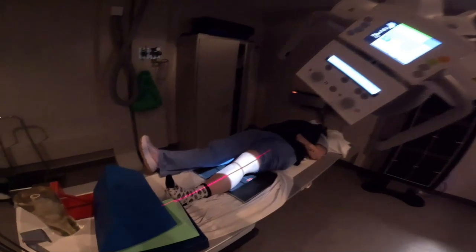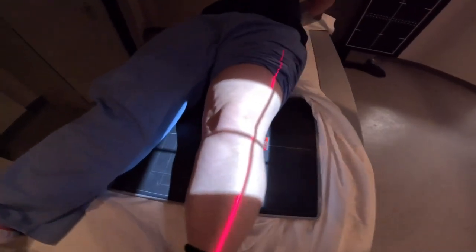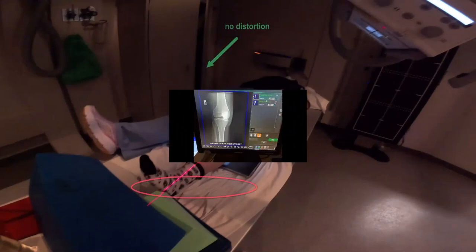So this is kind of our last resort option, where we don't angle the board underneath our patient. And what's going to happen when we do this is it's going to distort the knee and elongate it sideways, so it's going to make it look really wide when you take this picture, but it'll still look like an internal oblique. So worst case scenario, this works.